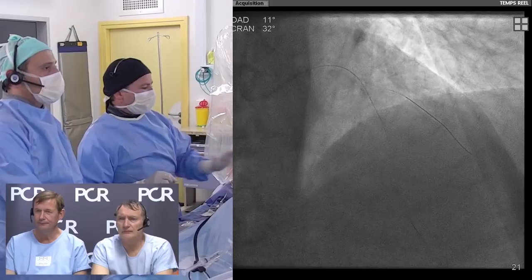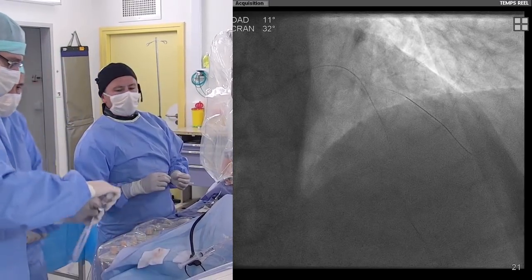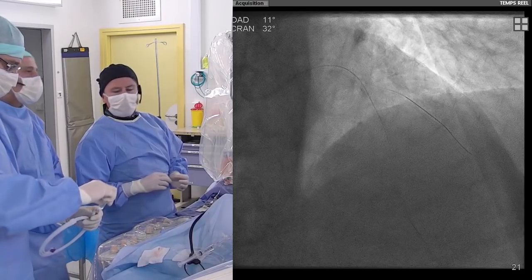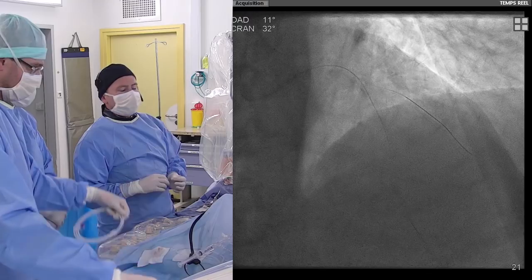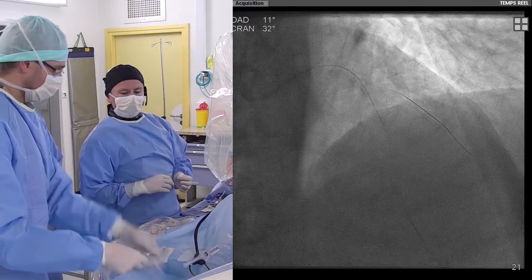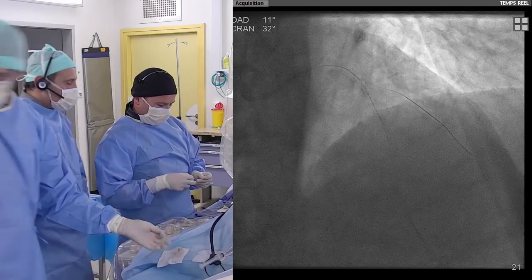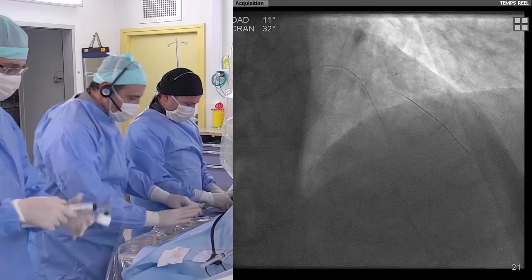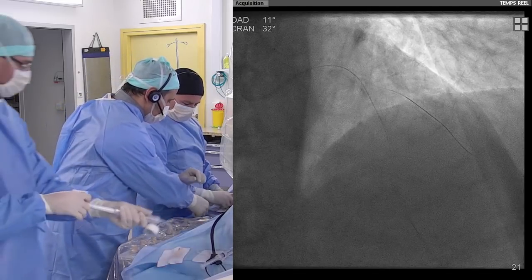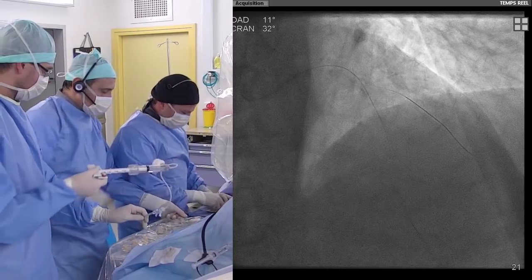We perform a small injection to avoid any damage in the left main. And I quite like the fact of having the ROTAWire still in place, because it helps improve support and pushability of our balloon, by the way, and it will work a little bit as a cutting device, like you're screwing an AngioSculpt balloon, and also to deliver the stent.